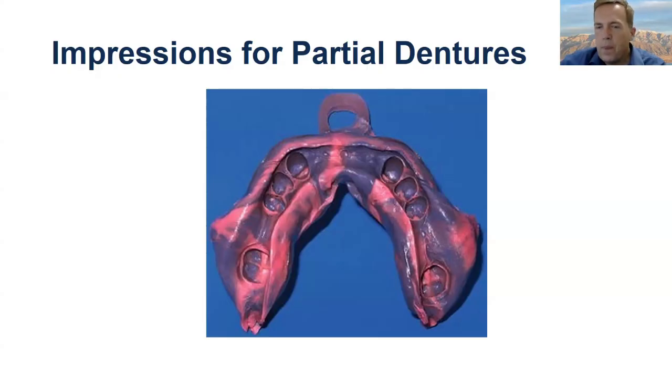One of the other things you got to watch out for with this is making sure you get the tray in and hold it. It's better to hold it yourself kind of in the premolar position instead of letting the patient bite on it. So that way they're less likely to move a little bit when it's setting and create those flow lines and all that stuff. This is a beautiful impression, by the way. If you get an impression like this, your laboratory will love you.